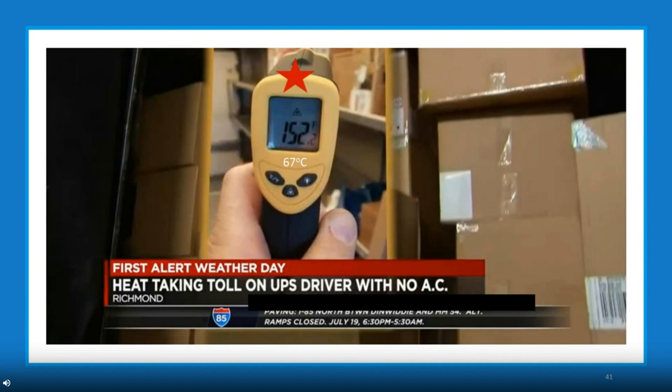degrees centigrade. And remember the study I showed you about the significant decrease in stability of the virus and the viral nucleic acids when the temperature increased up to even in the 40s. You can imagine what might happen to the stability of the virus and the stability of the specimens when they're transported at 67 degrees centigrade. So something we need to keep in mind when we do home collections and then have them sent into the laboratory for testing.